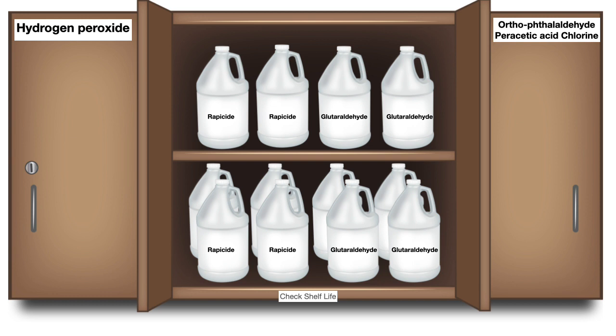Once you've opened it, you may have to use it again, and in that case, make sure you check the use life. So when you open, you need to put in your date and signature, and then looking at the use life, the disinfectant solution should be used before a particular amount of time, otherwise it will be ineffective. So these are two important principles: shelf life and use life.